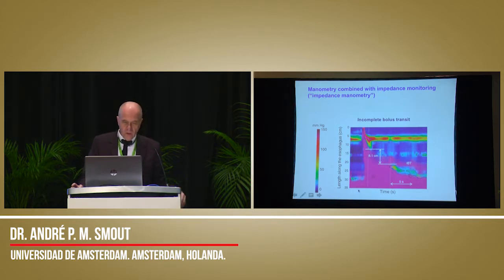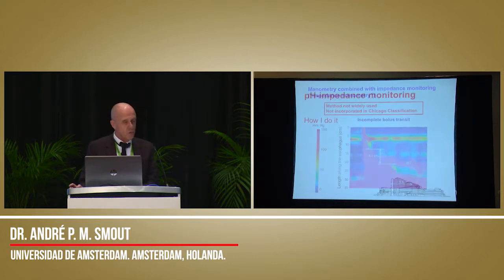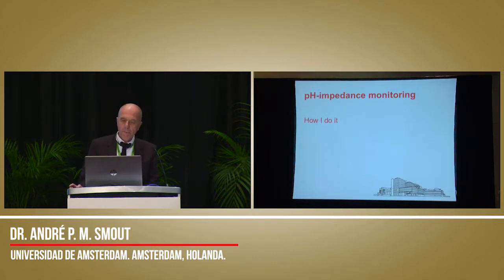I also told you that we have this equipment and use it sometimes for combining impedance with manometry. But again, we don't use it in clinical practice. It is not incorporated yet in the Chicago classification. So far about how we do manometry.